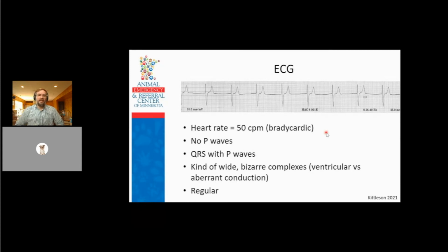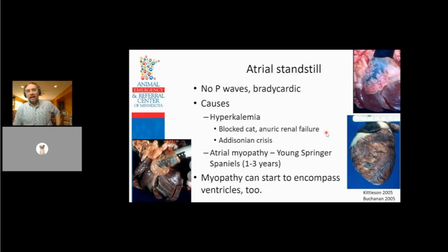And the complexes are a little bit wide and bizarre. So maybe are they coming from the ventricles, or are they just conducting aberrantly through the ventricles? But it's a very regular rhythm. But this is essentially atrial standstill.